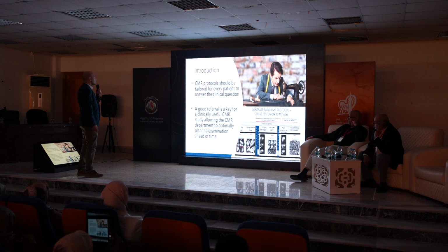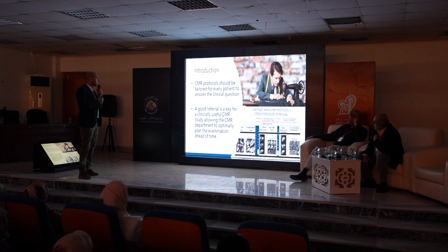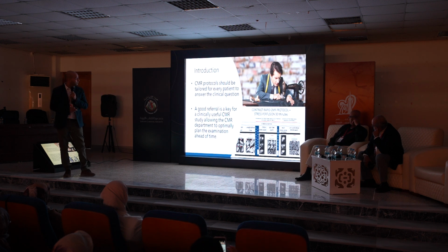CMR protocols should be tailored for every patient to answer the clinical question. So, a good referral is key for a clinically useful CMR study, allowing the CMR department to optimally plan the examination ahead of time.